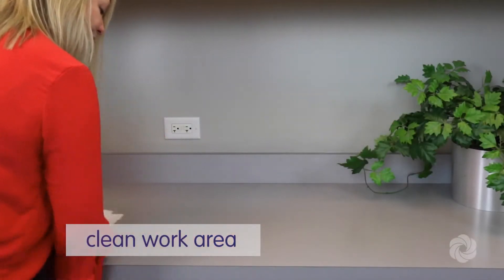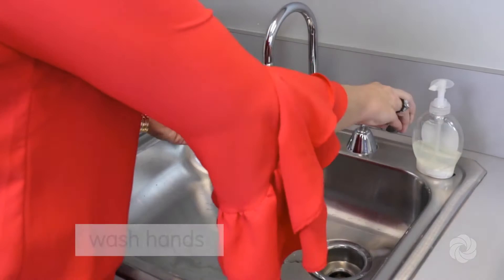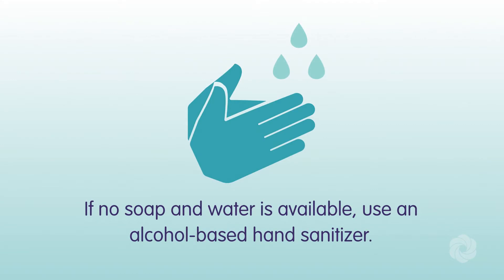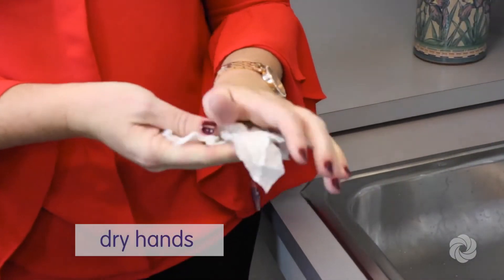To get started, select a clean work area. Once established, clean your hands thoroughly using antibacterial soap and warm water. If no soap and water is available, use an alcohol-based hand sanitizer, followed by drying your hands with a clean towel.